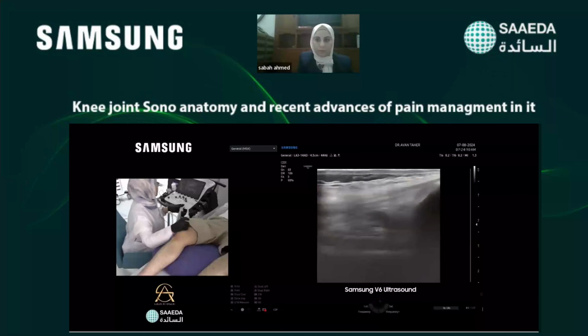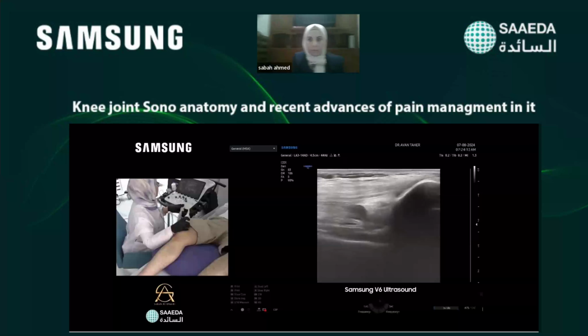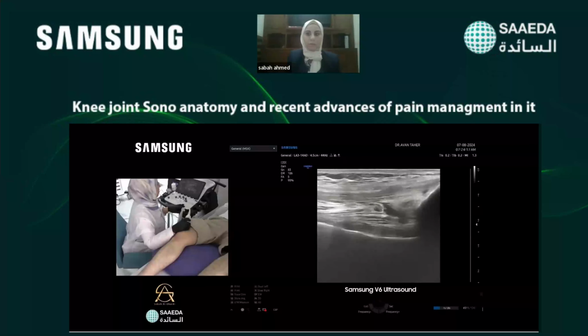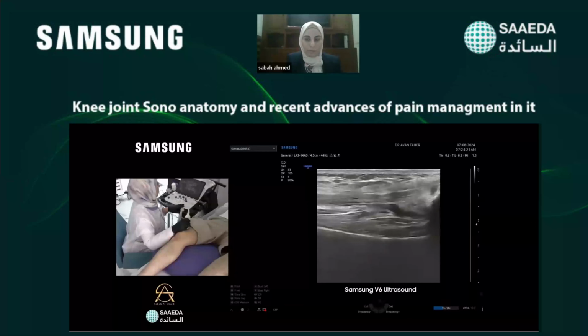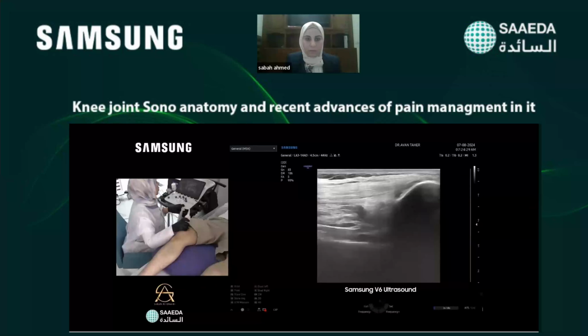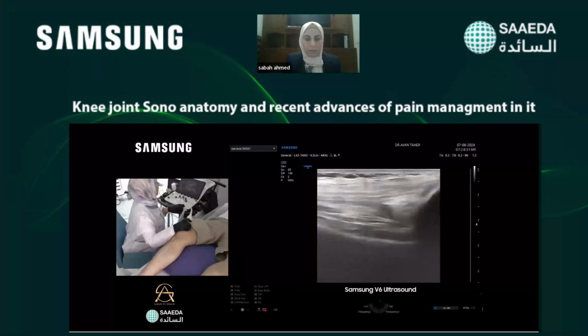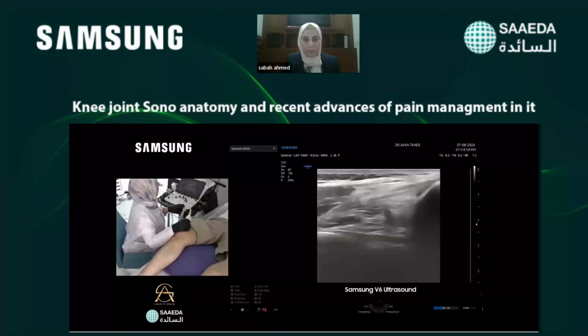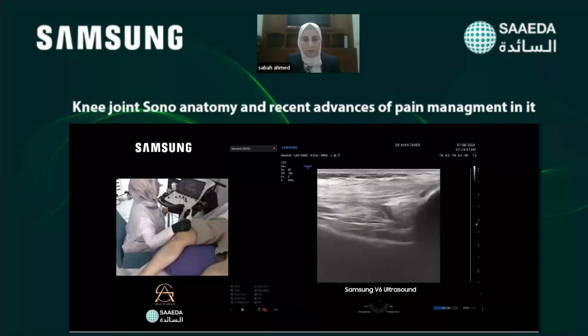So again, to see it more clearly, this is the patella. This is the quadriceps tendon. Suprapatellar fat pad, suprapatellar recess, prefemoral fat pad, and articularis genus muscle. This is the articularis genus muscle. This begins in the suprapatellar part. But this suprapatellar recess, we can't inject by this longitudinal view. We can go to the short axis view to inject in the suprapatellar recess.